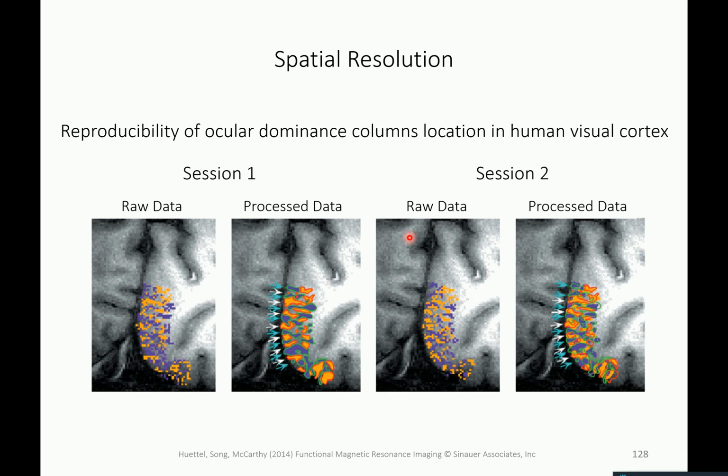However, having said that, for cognitive neuroscience studies, under certain imaging protocols and under certain biological neurovascular settings, you can definitely get something more. The first example for today is the ocular dominance columns in visual cortex. This is a little bit older, I think early 2000s, where the Minnesota group did this. So this is human fMRI.